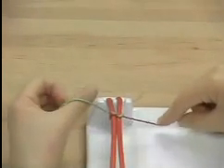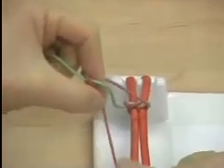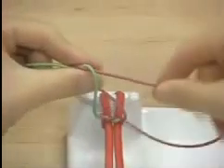The thumb of the left hand is brought up underneath, encircled pincer created, limb retrieved, and brought through the knot, and laid down in a square position.